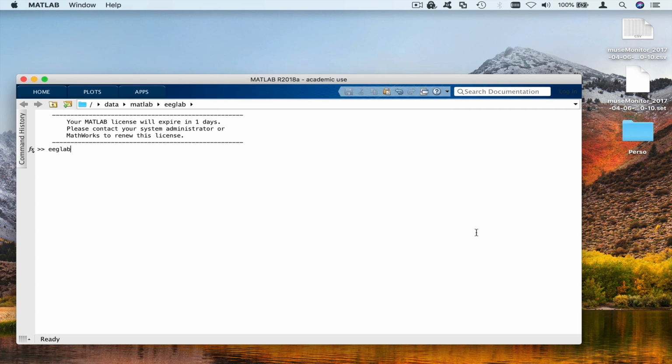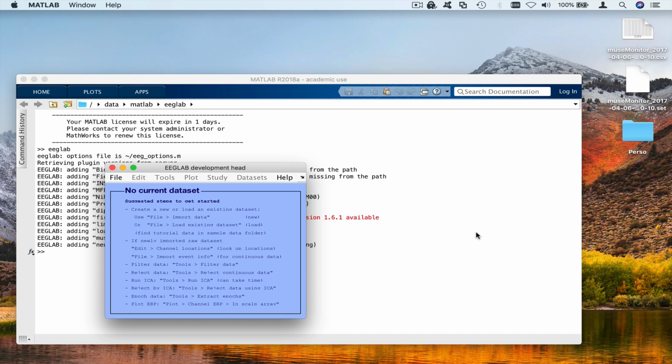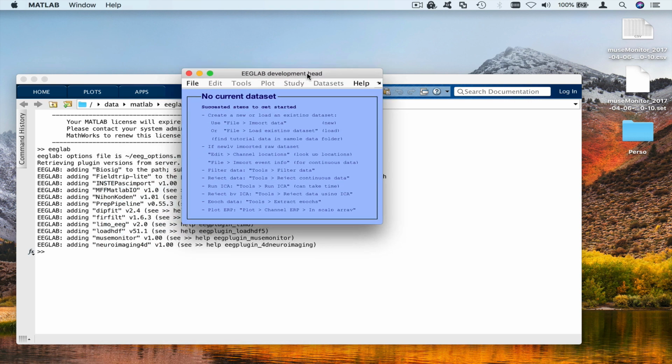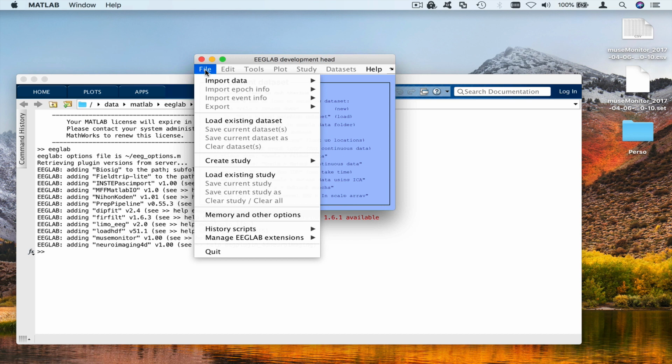So if you have MATLAB, you have to type EEGLAB to start EEGLAB. And if you just installed MATLAB, EEGLAB, then you'll have to install the Muse importer. So to do that, you go to Manage Extension, Data Import Extension, and you would select the Muse import extension. I already have installed it here, so I don't need to do that. If you have the compiled version, it's already installed by default.